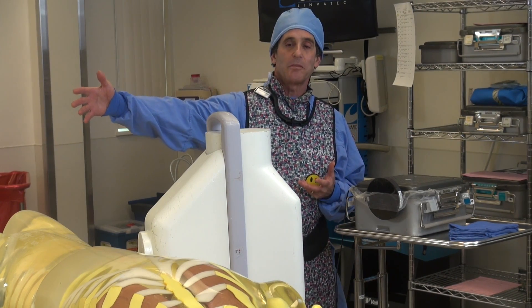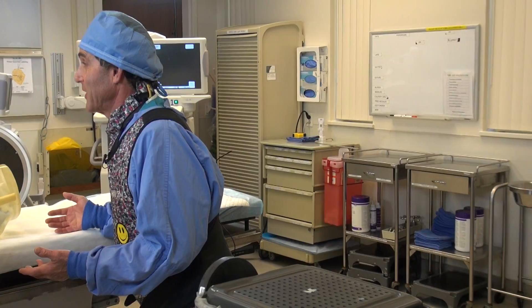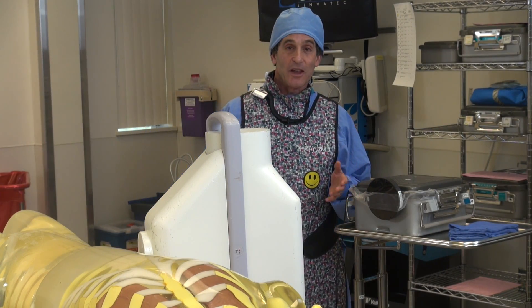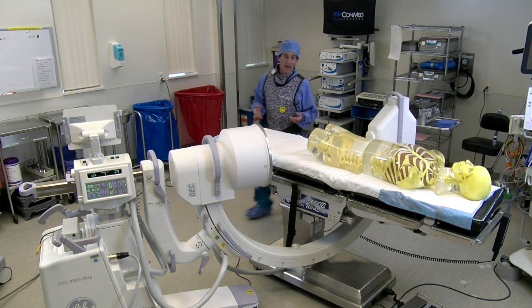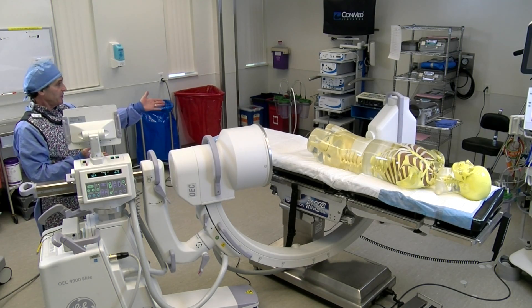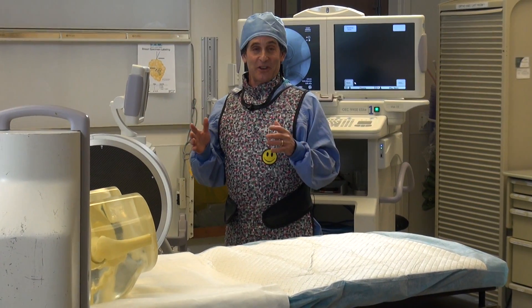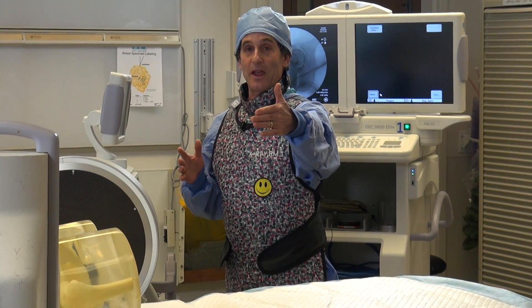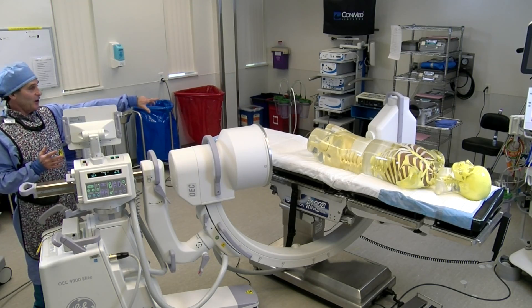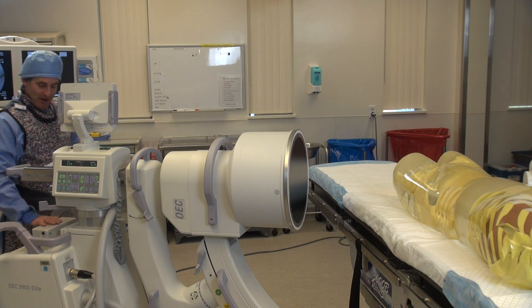The surgeon is kind of right on the patient, and when the x-ray fires they lean back a little bit — they rarely can get back to four feet. So when we're making those exposures, they're going to get more dose than what this ion chamber shows. Inverse square law tells us that if they're at two feet away, they're going to be getting four times the dose of this ion chamber at four feet.